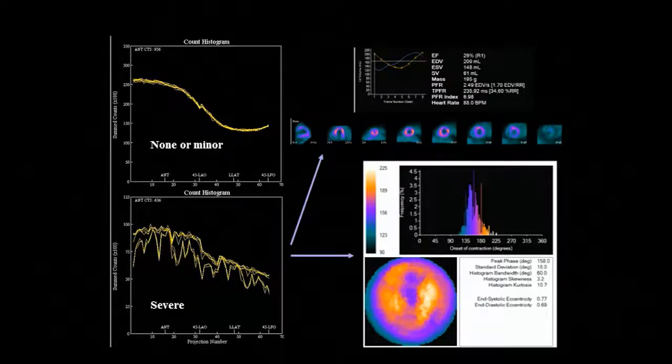If you have list mode gating, which I know you all have with CZT, you have the option now, and the advantage, of correcting for gating errors and getting excellent results for dysynchrony even in patients who have artifacts, gating errors and arrhythmias, although you would be losing a considerable number of counts if you took the gating errors out.